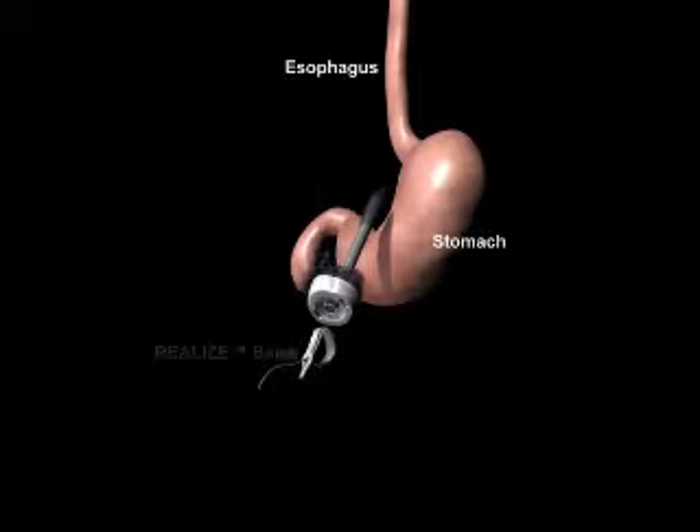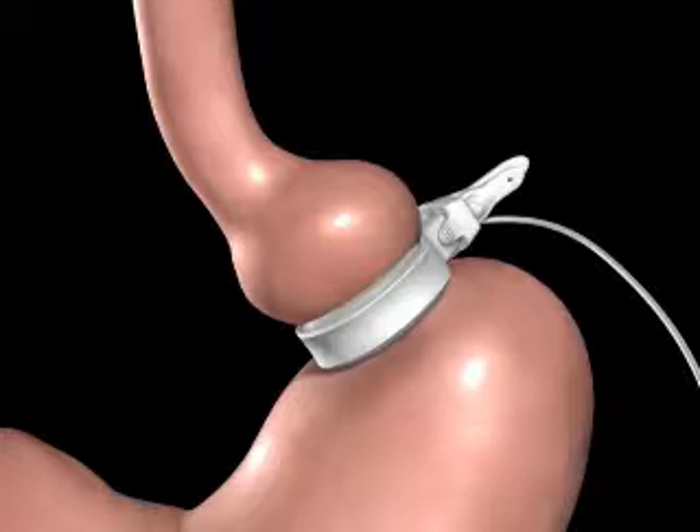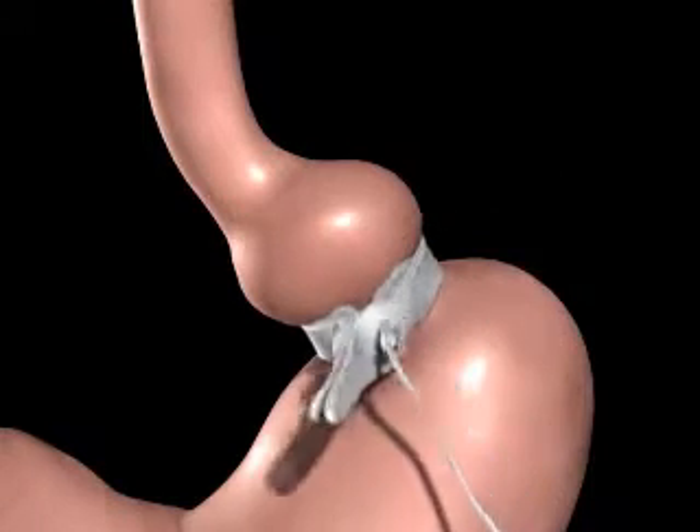The realized band is introduced to the abdomen through a trocar. The realized band is positioned around the upper portion of the stomach and then secured using the locking mechanism.